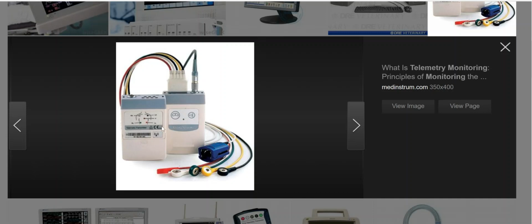The telemetry monitor sends information wirelessly. So it receives information through these wires that are positioned white over right, smoke over fire, so the black, the red, the white. The precordial lead is brown with the green lead on the opposite side. It transmits the information it receives to the central station.